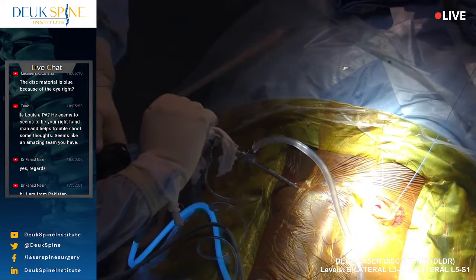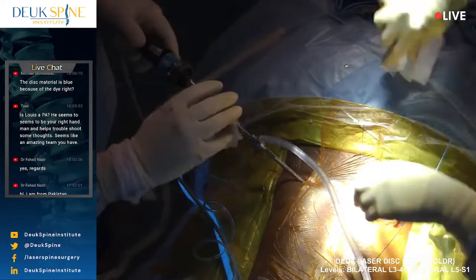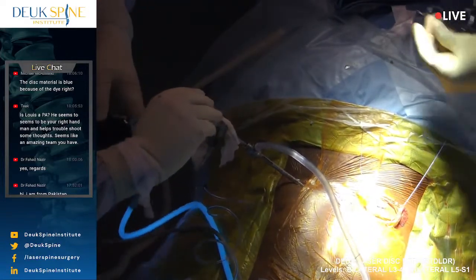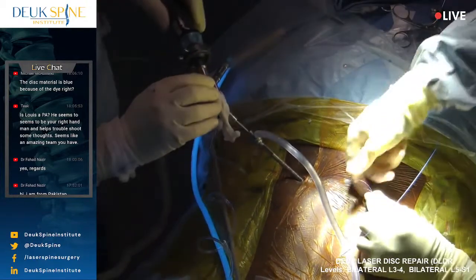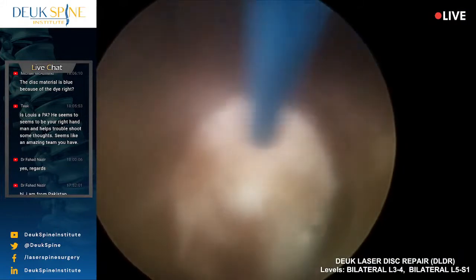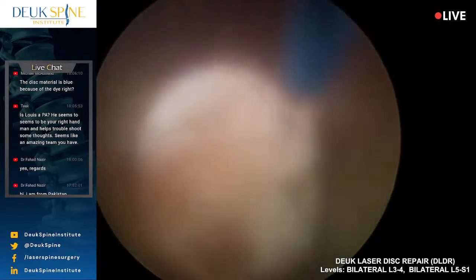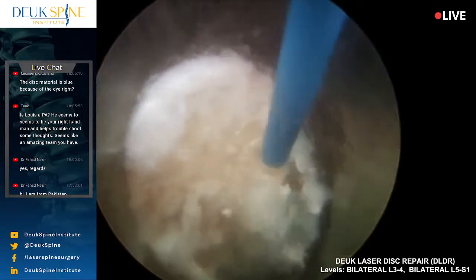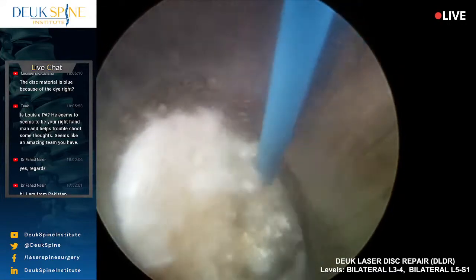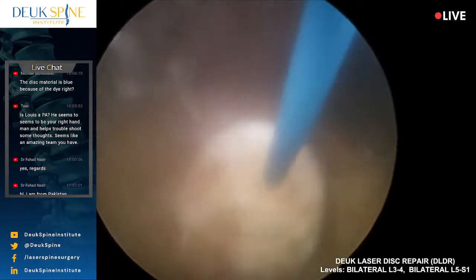He's moving around a little bit more than I want. Just about done. I need 5 more minutes. He's not happy with this. You have him strapped both ends, Luis? Strapped in both ends, top and bottom, right?